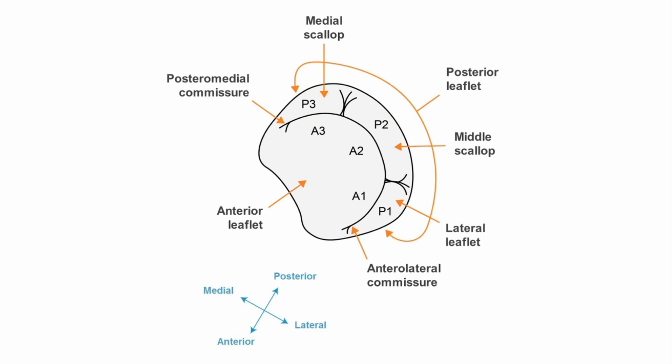The leaflet segments are numbered starting from the anterolateral commissure which lies nearest to the left atrial appendage, where the A1 and P1 segments are, across to the posteromedial commissure where the A3 and P3 segments are.